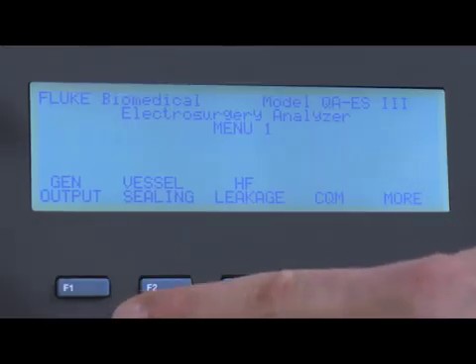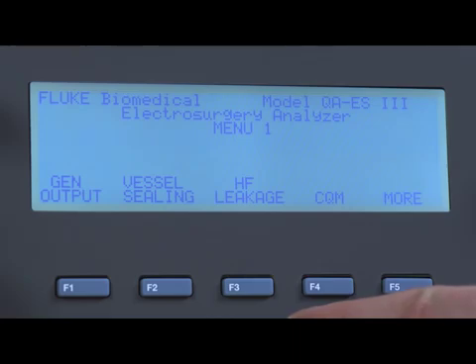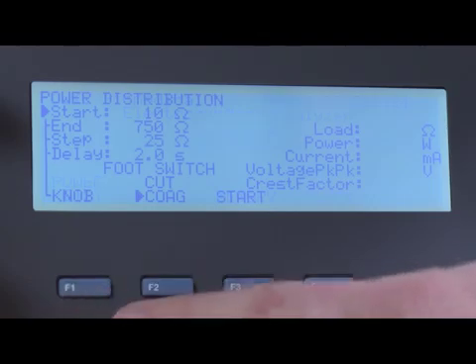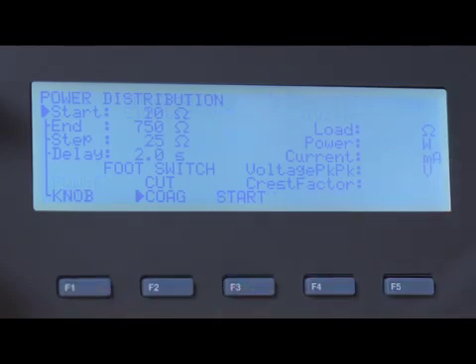The QAES-3 collects all measurements including vessel sealing, high frequency HF leakage, contact quality monitor, and output power distribution in single or continuous mode. It also measures cut and coag waveforms with either monopolar or bipolar outputs.